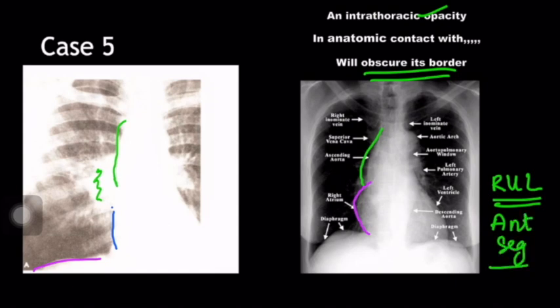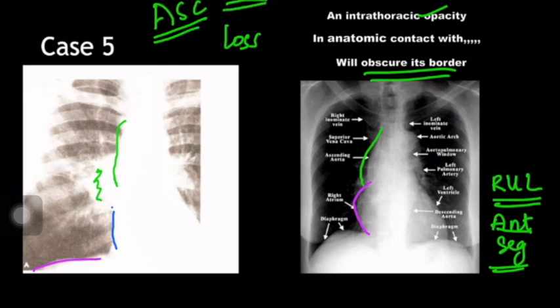I again urge you all to go back and review the segmental anatomy — how the lung is divided into lobes and further into segments, and how you can identify the segments on chest radiograph. By applying the Silhouette sign, that is the loss of Silhouette sign, any lesion obscuring the ascending aorta can be localized to the right upper lobe, to be specific, the anterior segment.